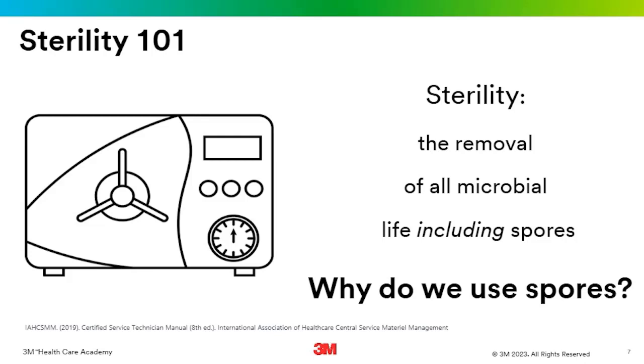But the FDA recognizes the accumulated lethality, the ability of exposure time and other parameters coming together to sterilize instrumentation in a way that even destroys spores. So that's only one part of our job responsibilities, right? All condensed into one small 101 slide.